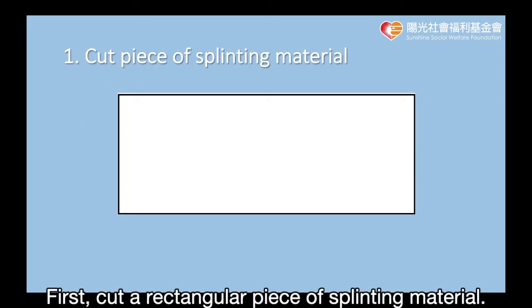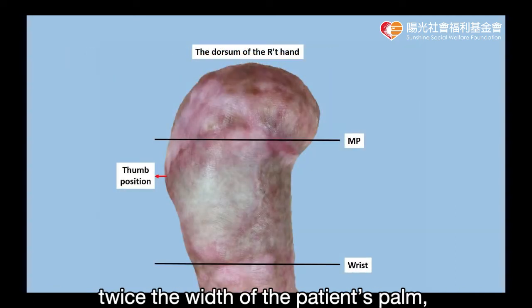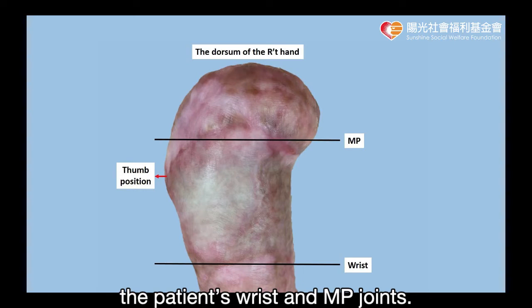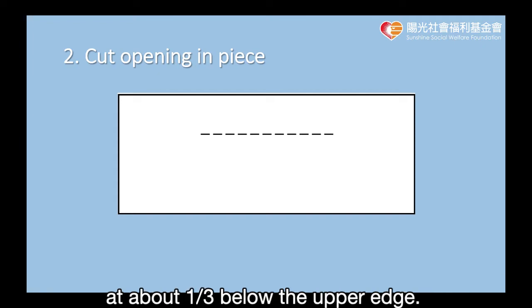First, cut a rectangular piece of splinting material. Its length should be about twice the width of the patient's palm, while its width should be about three-fourths of the distance between the patient's wrist and MCP joints. Cut an opening in the center of the splint, at about one-third below the upper edge.